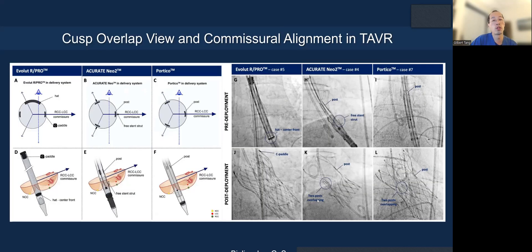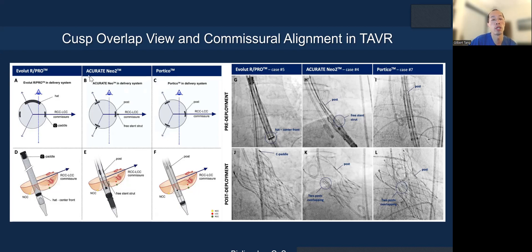For commissure alignment with self-expanding valves — Evolut, Acurate, and Portico — you can line up the hat marker on the Evolut with the commissure post fluoroscopically. When you deploy the valve, one of the commissure posts should be facing the right side of the screen, confirming good commissure alignment. Commissure alignment may also reduce neo-skirt height: if the leaflet is plastered to the top of the valve, the leaflet or neo-skirt height can be quite tall, but with leaflet modification enabled by commissure alignment, you can substantially lower the neo-skirt height.